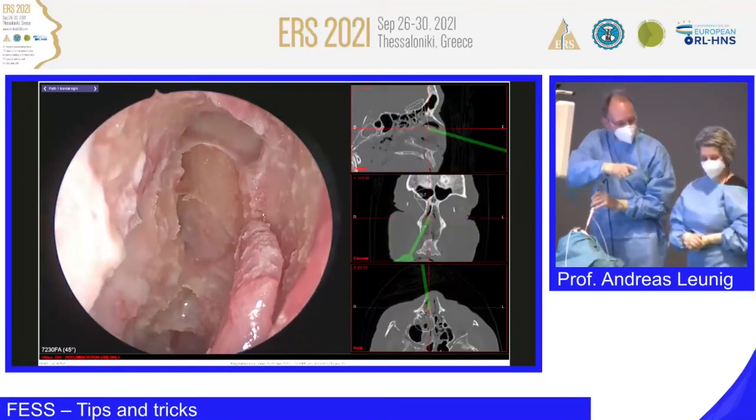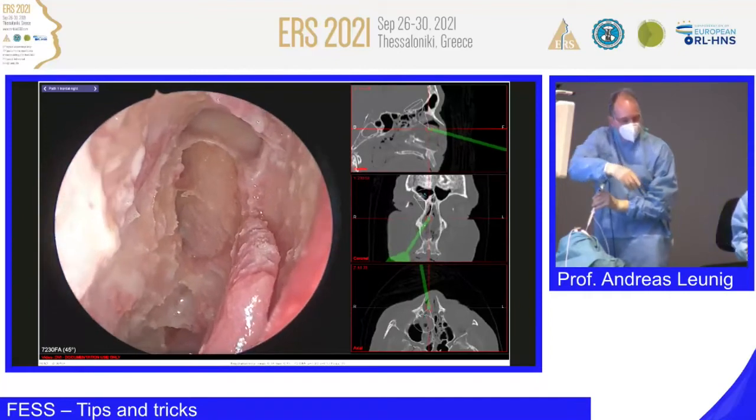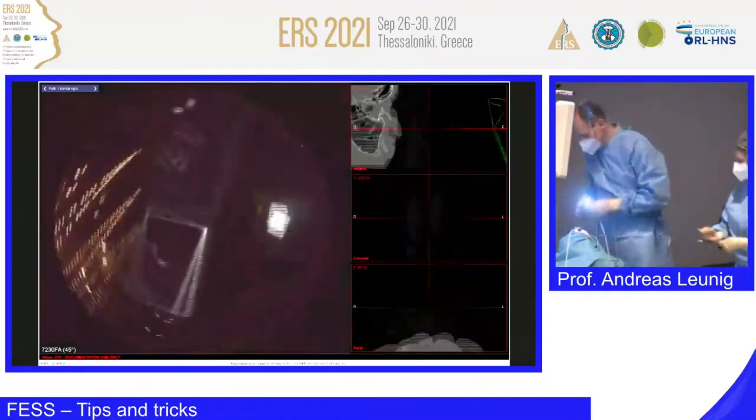So give me please the bipolar forceps, in case you have a bleeding. Zero degree optic.